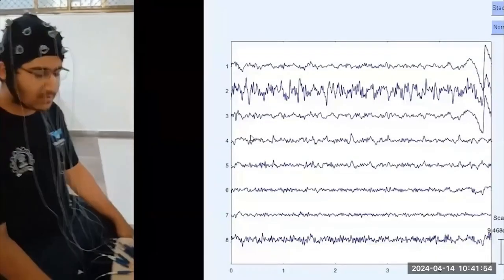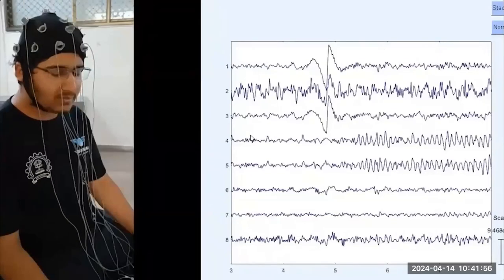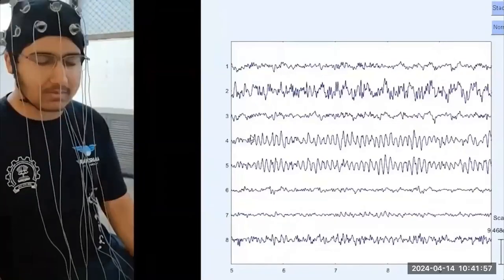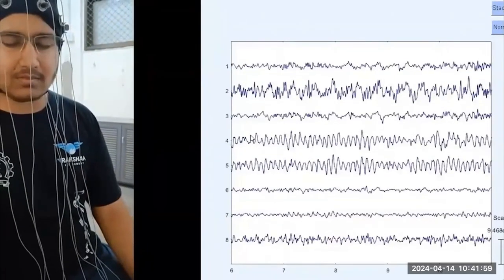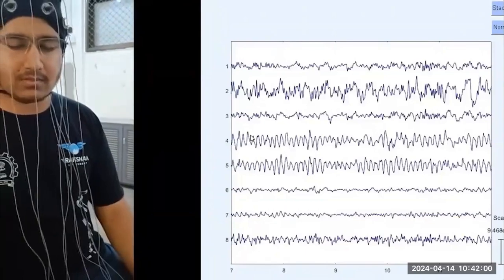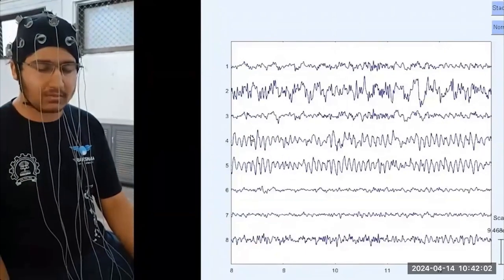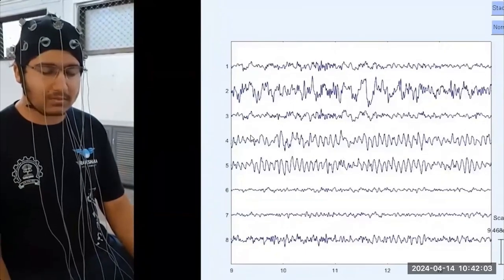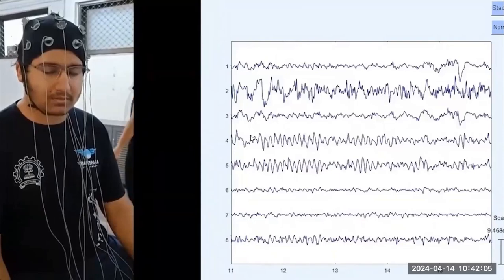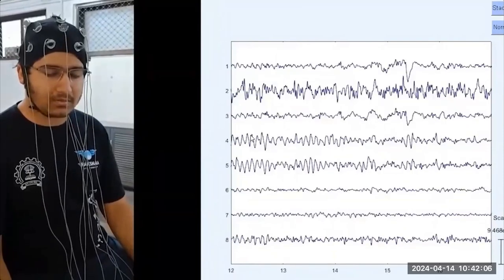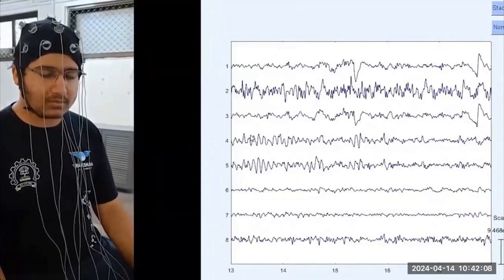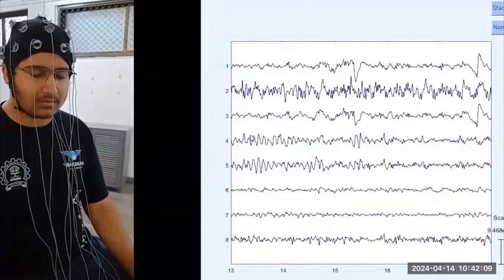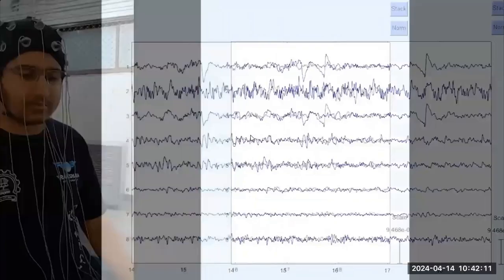In this demonstration, we can see that from timestamp 5, an increase in amplitude in channels 4 and 5, which are connected to the rear side, was observed. At about timestamp 15, he opened his eyes and again a decrease in amplitude is seen.